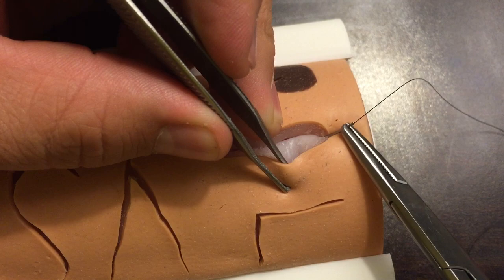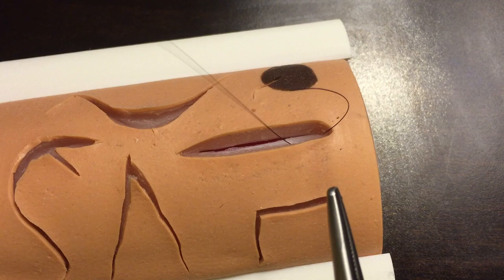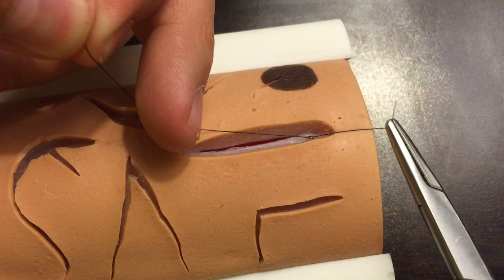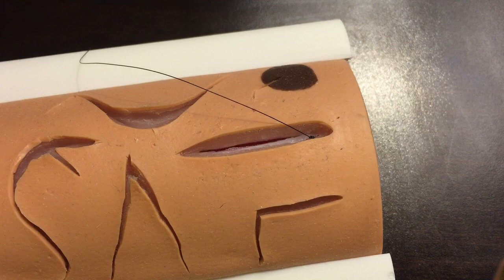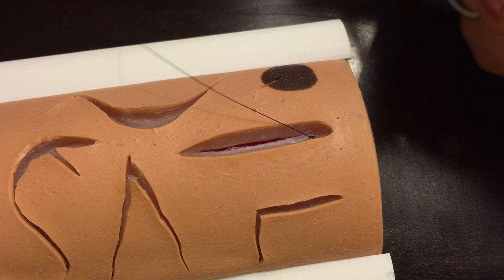To anchor the suture, anywhere within the depths of that laceration or incision is just fine. Lots of providers do it in different ways — they might reach across and grab some subcutaneous fat or anchor it differently. The main purpose of this first throw is simply to create an anchor deep within the laceration or incision. Cut the tail very small so that as it closes up the tail isn't poking out of the skin — you want it to stay buried.